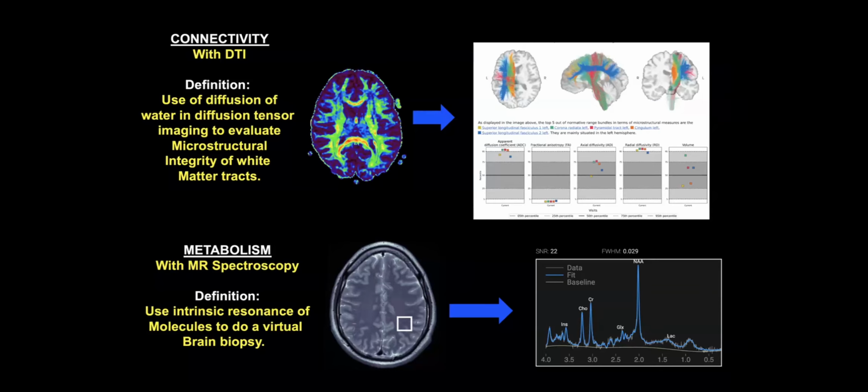This is probably the part of the scan that we don't do as much because it's more technically challenging in terms of just what scanners have the ability to do it. Newer scanners tend to have a better way of doing it than older scanners, although older scanners can do this as well with some modifications. And so that's another example we can get.